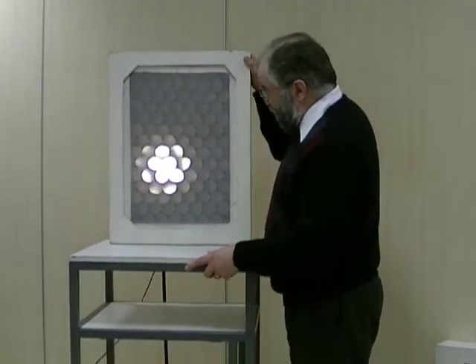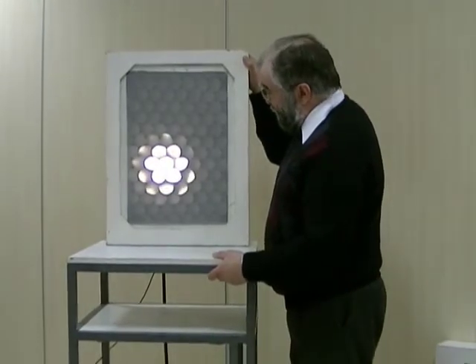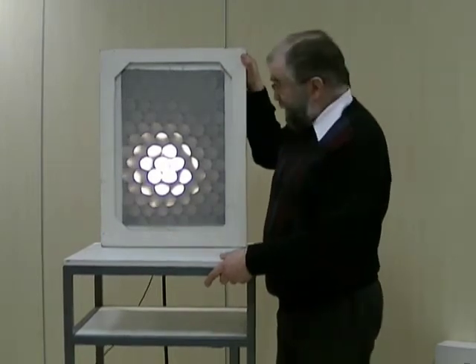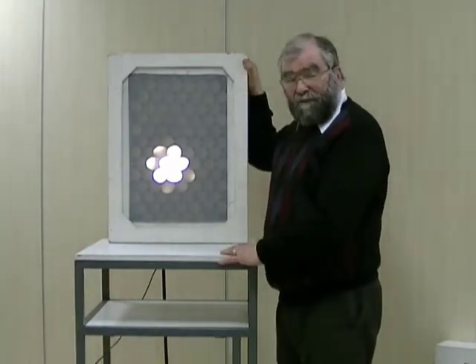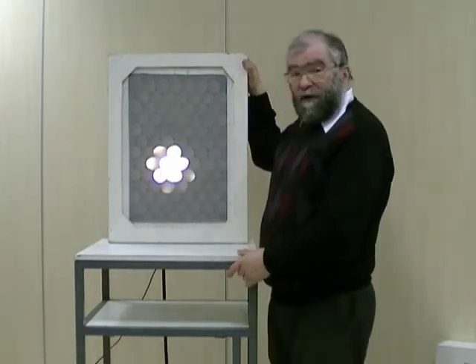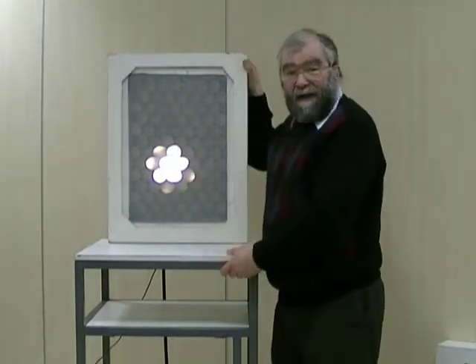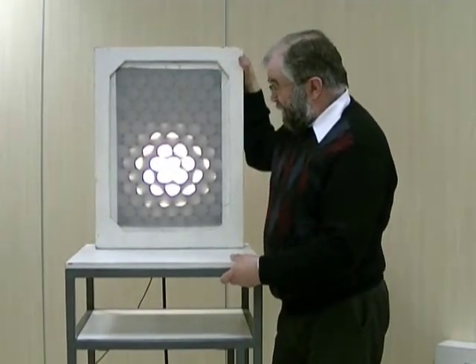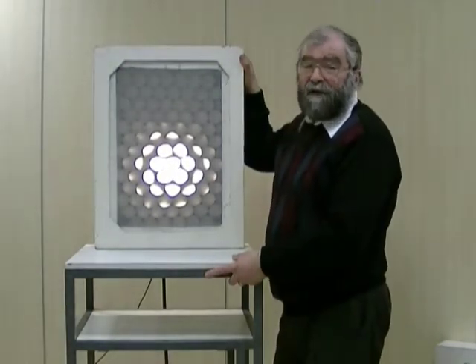The brightness of any one individual spot representing a hole in the collimator gets dimmer. So when we're close up, we have a few bright spots. As we get further away, the brightness of each spot goes down, but we get more of them, and the total amount of light stays the same. The brightness of any individual hole goes down according to one over the square of the distance, but the width and height of the spot increases according to the distance. So the total area, and hence the total number of spots, increases as the square of the distance, and those two effects exactly cancel out.